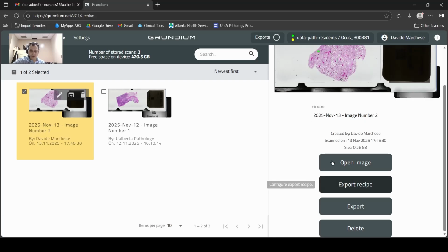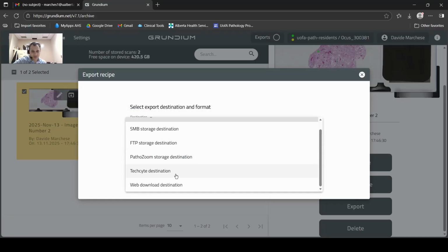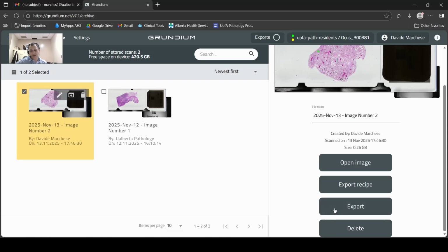Actually, we're going to show what happens when you do the web search. Let's change that. Because there is no USB attached, it won't work. So hit save, export. So now it is loading. You can see this here, very self-explanatory. This was quite fast because it was a very small image, but I could save it or do whatever I please.